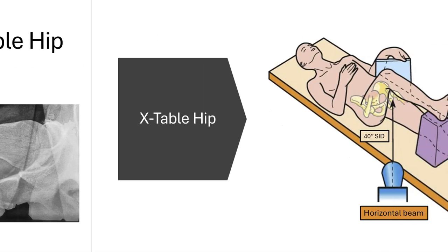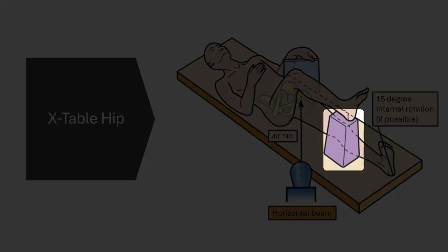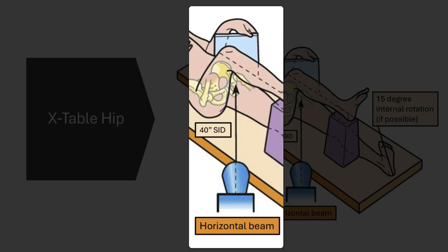For now, we're going to assume that this patient has just one leg that's hurt, their left leg. So you can see I have the right leg up on a stand. We have different types of stands that we use, but the foot is going to be out of the way so we can get our beam underneath and just get to that one hip of interest. Okay, and you can see here the patient's holding the cassette. You don't necessarily need to have them do that. I would just use the plate holders that we have. Makes it a lot easier.